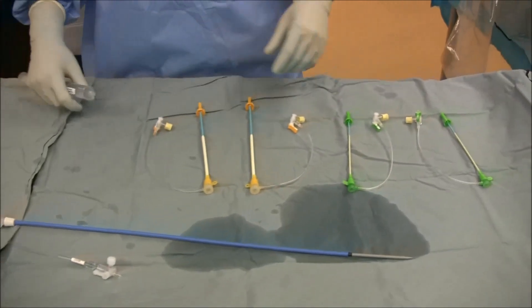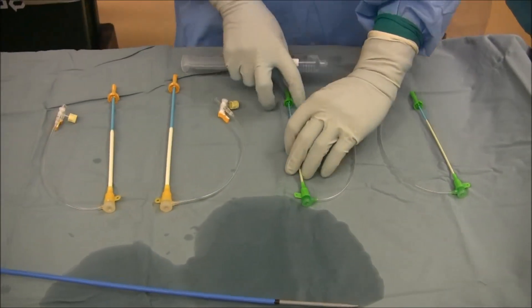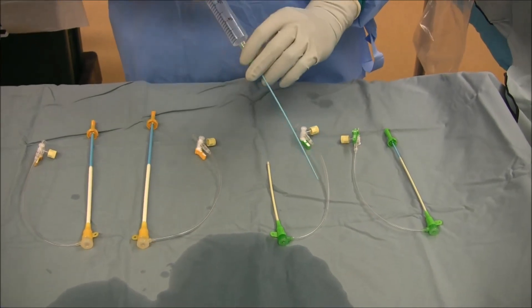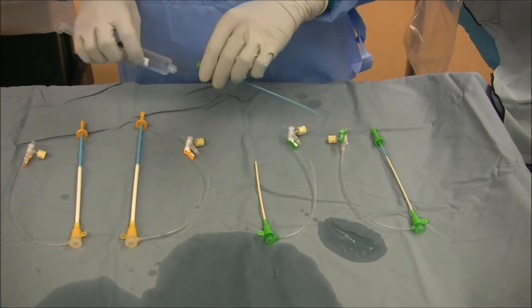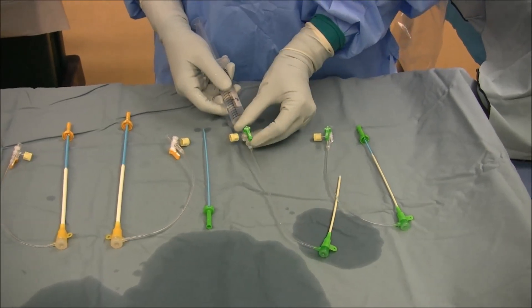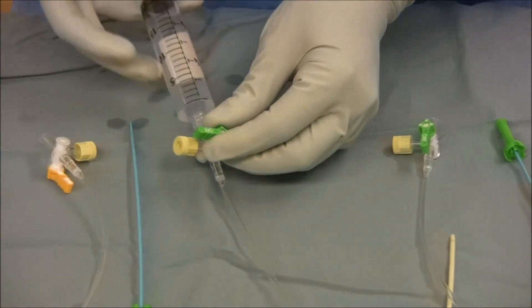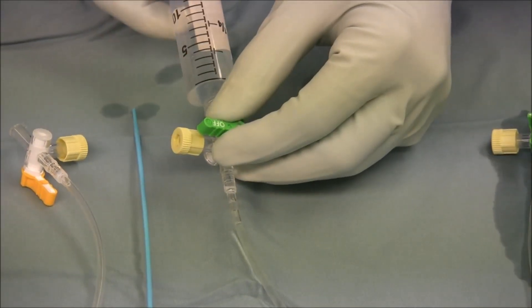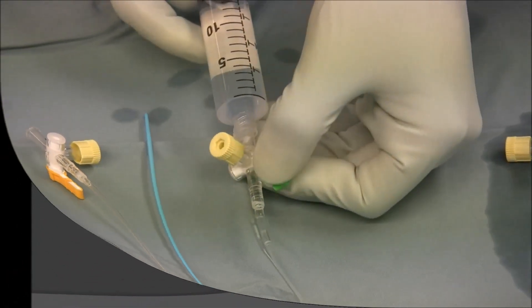The remaining sheaths are similarly flushed. Again, the stopcock is turned toward the flush port after flushing.